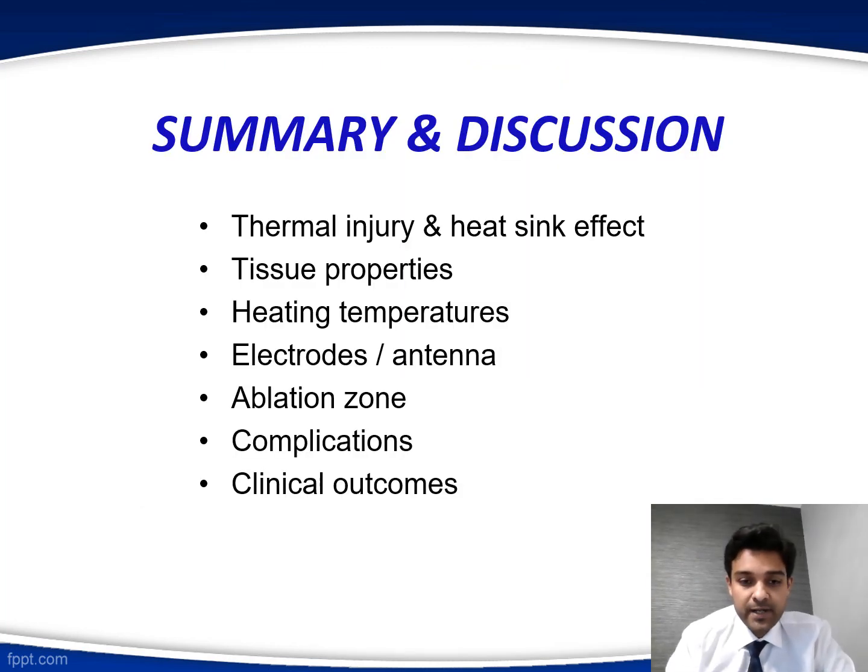I would like to summarize by stressing on few major topics that we have gone through in the last session. First would be thermal injury, the presence of the pads that help complete the circuit and reduce the risk of burns for the patient. The pad also acts as a dispersive pad that absorbs the thermal energy. Heat sink effect plays a major role in radiofrequency ablation, whereas it is attenuated in microwave ablation.